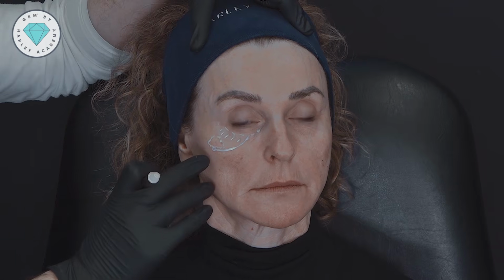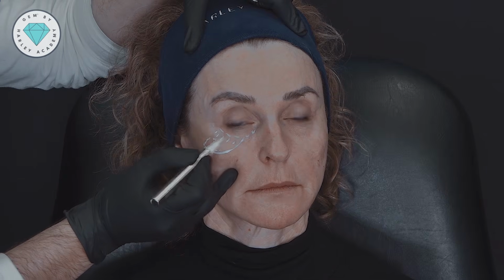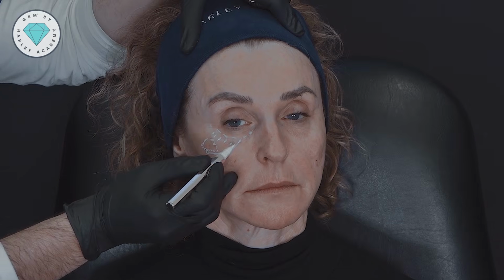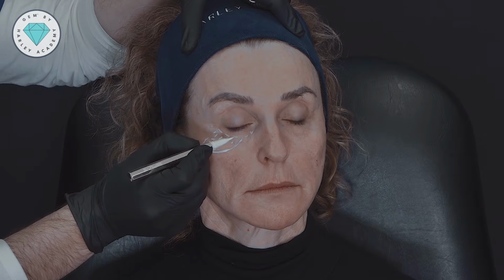And so even though we have restored volume in the apex of the cheek, we start to see this characteristic bony ledge over the lateral aspect of the under eye. This is not the tear trough, this is a specific groove that's revealed as the tissues move downwards. And we can treat this because it's something that requires additional volume. But the fat pad target here is something called the interlaminar fat, which is the fat that lives between little bands of the orbicularis retaining ligaments.